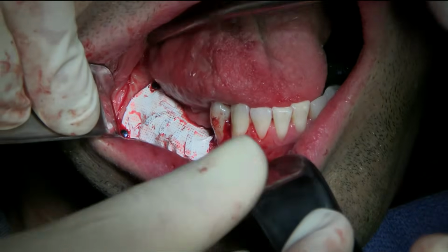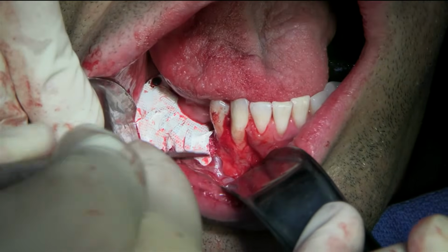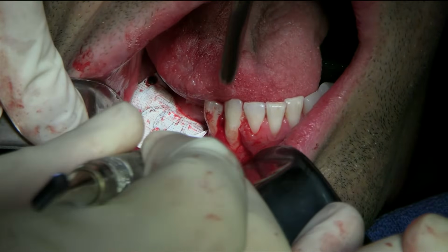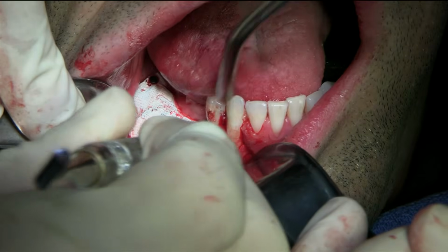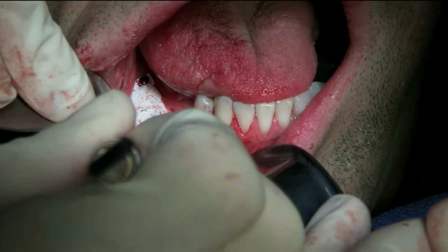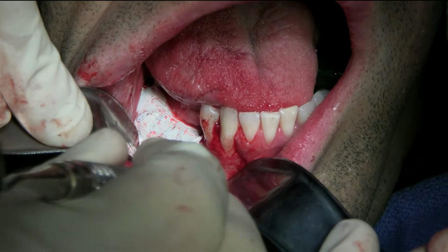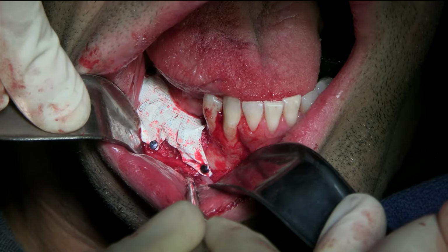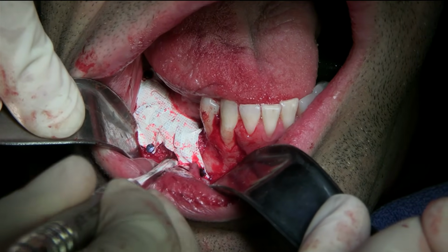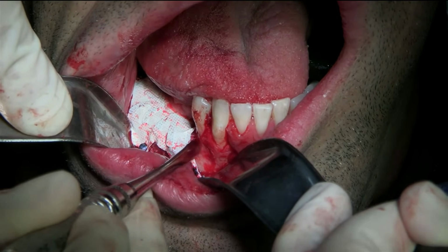Got it. Okay, so we have 3 tacks on the buccal. The fixation is good. I got an opening here around the mental foramen, and that's good. The seal in the back is, I would say, perfect. So the only place where I need a membrane to cover the bone graft, can you see that? I'm just going to cover with collagen right over the mental foramen, or just below it. And then here in the front.